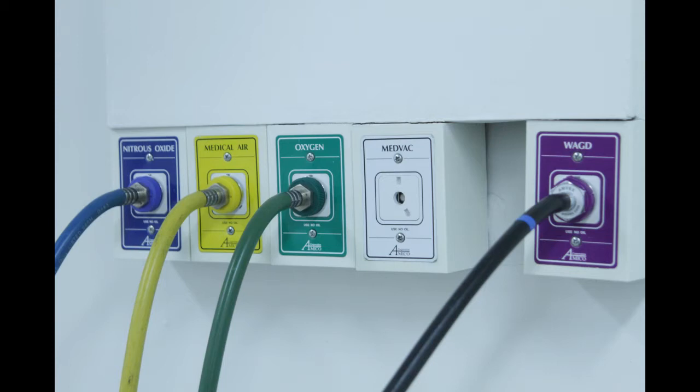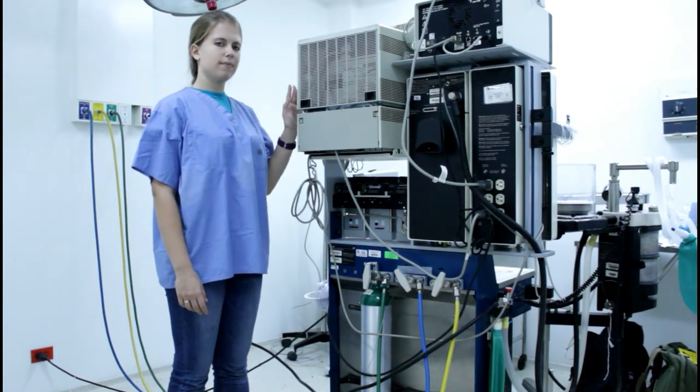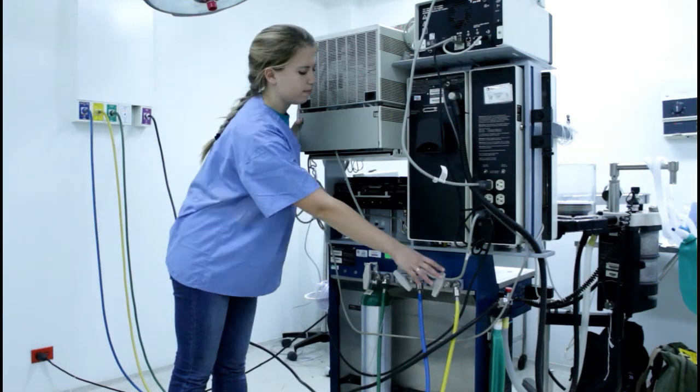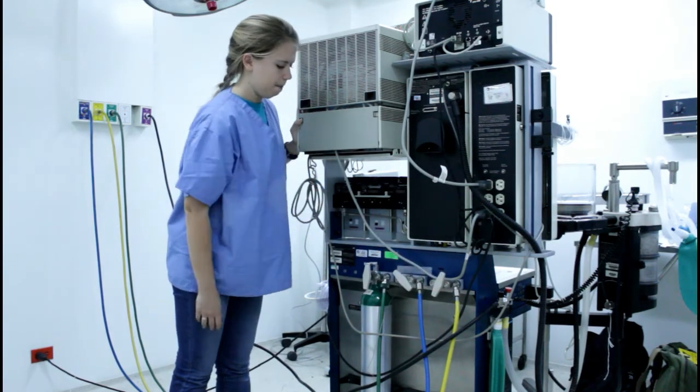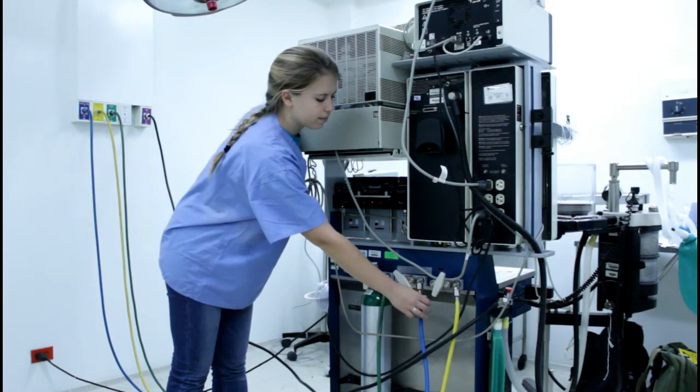In this video, oxygen is green, nitrous oxide is blue, medical air is yellow, and the output hose is purple. The central supply is used under normal conditions. Issues such as power outages may force the use of cylinders. The central supply wall outlets connect to ports above the cylinders on the anesthesia machine using thick tubes.